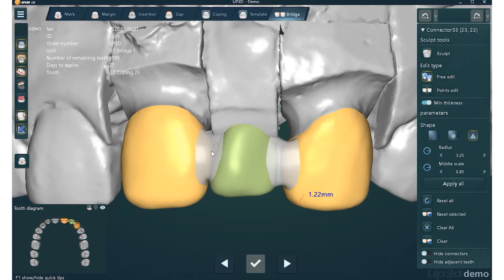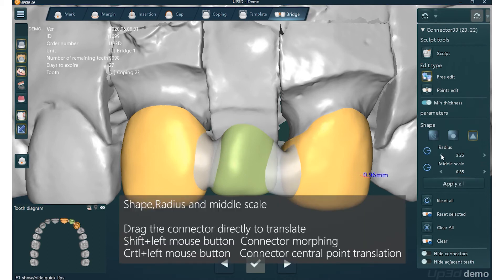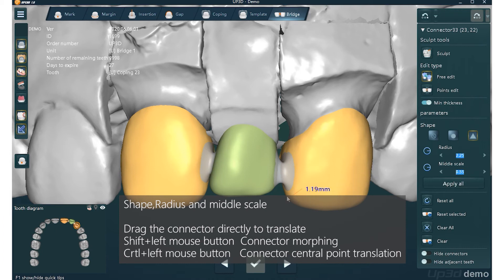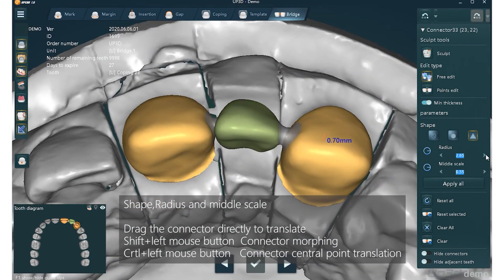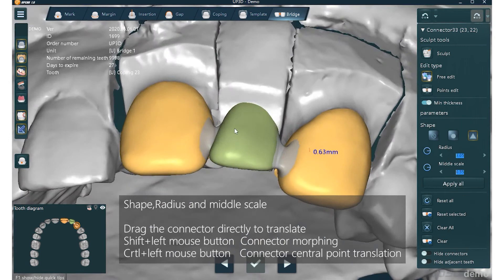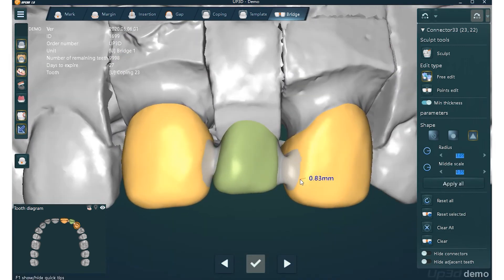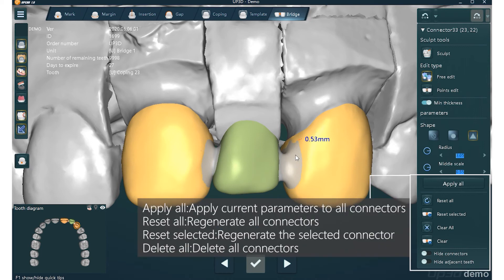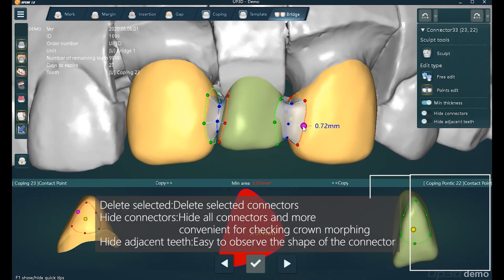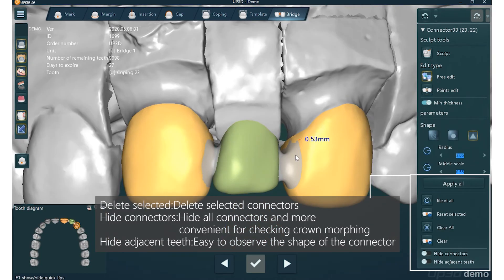Connector Free Edit means adjusting the connector roughly. The shape, size, and scaling of the connector can be changed according to the crown shape. The adjusted connector changes in real time. Drag the connector directly to translate. Use Shift and left mouse button for connector morphing. Use Ctrl and left mouse button for connector central point translation. Note: you can delete the connector when two crowns have collided, and please don't make the connector too low to hit the margin area of the crown.